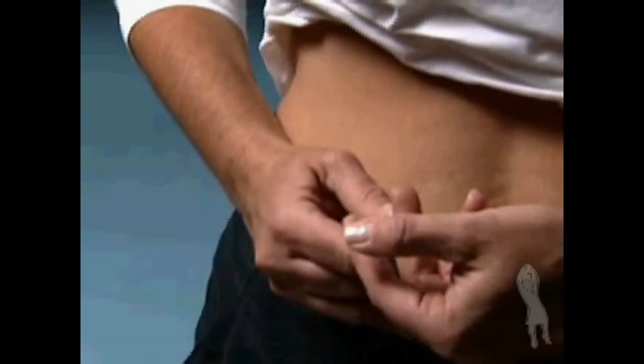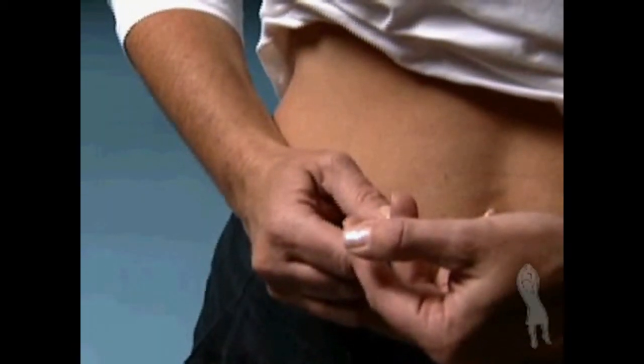Hold the syringe in one hand the way you would hold a pencil. With the other hand, pinch the skin around the injection site. Insert the entire length of the needle into the skin at a 45 to 90 degree angle.